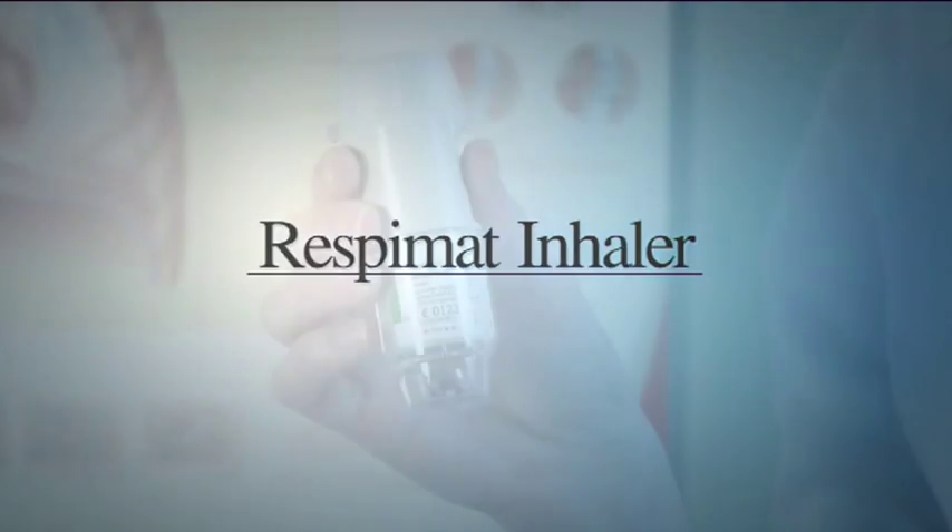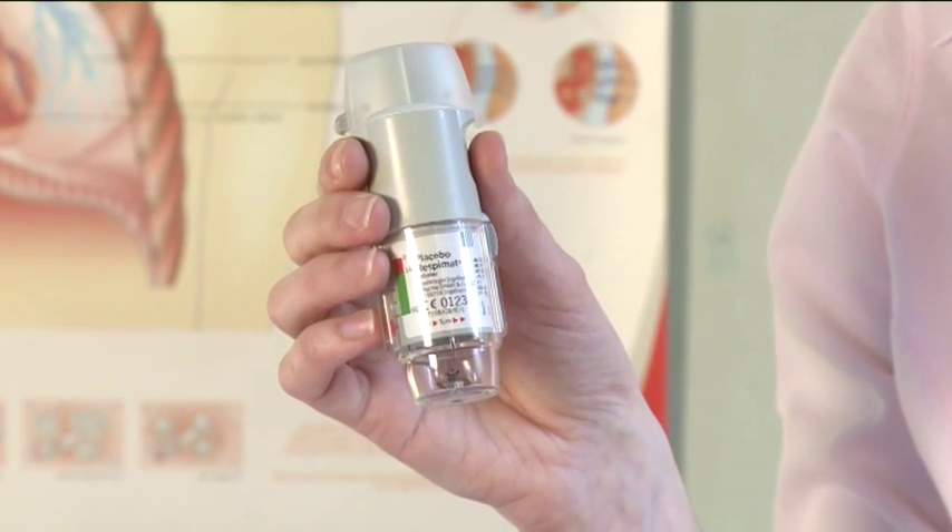Respimat inhaler. In order to use the Respimat inhaler, you need to first insert the cartridge into the inhaler device.